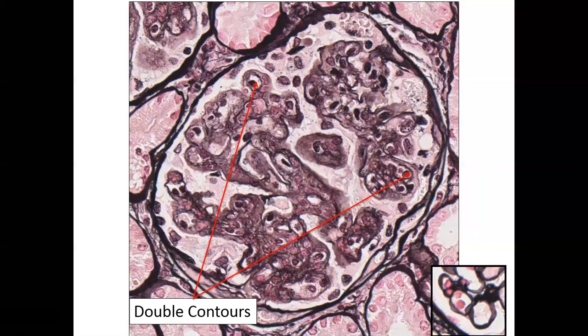So, yes, we have a question here. The top arrow at the end of that, is that one they hold? Yeah, so perfect. So here we even have the nucleus of a mesangial cell, and it is not within the mesangium proper. It's out here in the capillary loop itself. So this is a mesangial cell that's almost started to migrate out. We have a couple of really great pictures of EMs of that type of lesion, but I get 20 or 30 glomeruli on a biopsy that I do histology on, and then when I get EM, I might only look at one glomerulus. So being able to catch that in the right section is really difficult. But yes, that's a good pickup, Josh.